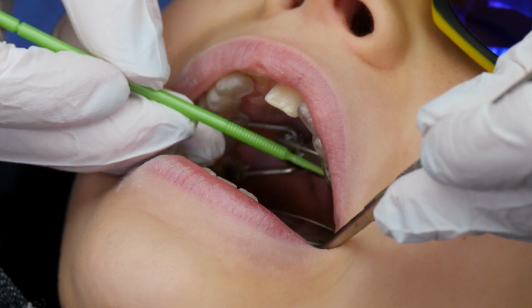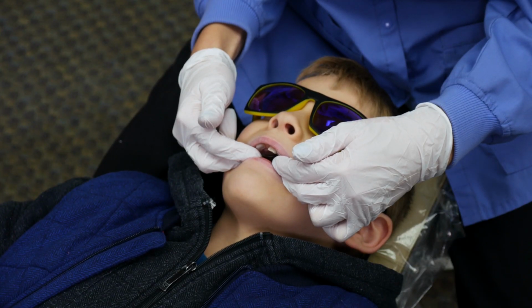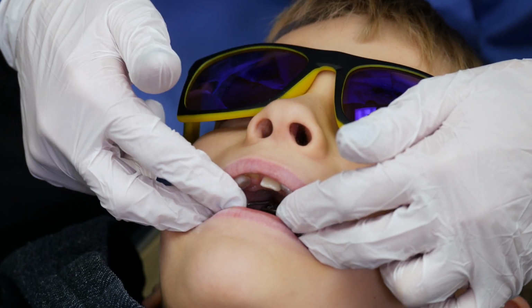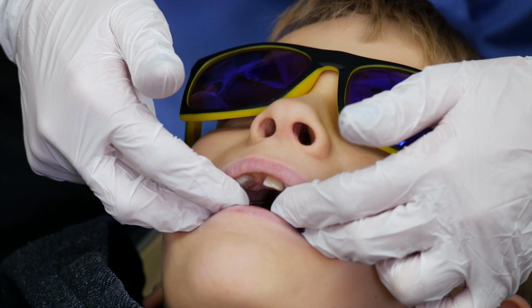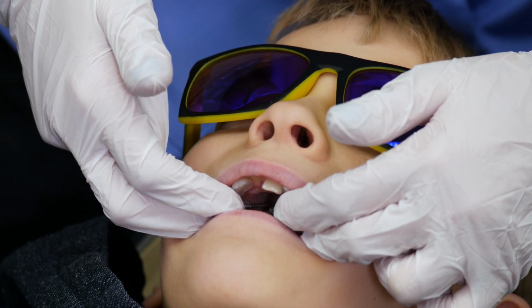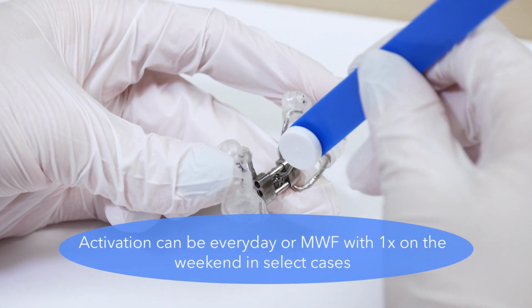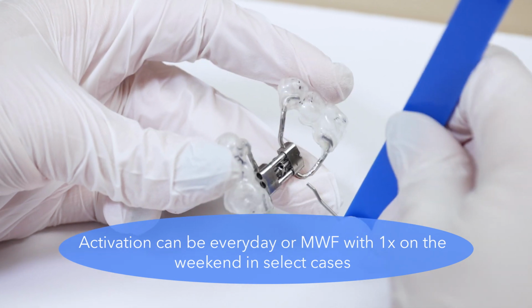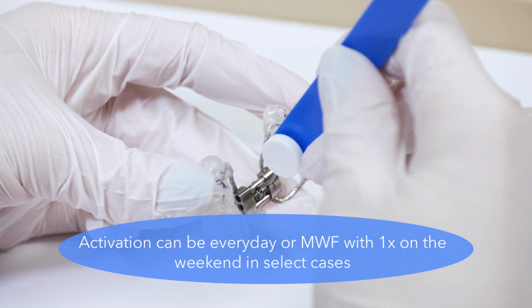Once this has been accomplished, light pressure should be maintained on both sides for 3 to 4 minutes. This completes the placement of the DCE, and final instructions for the parents can begin. It's helpful to have a sample DCE to show a parent out of the mouth how to place the activation key into the screw.